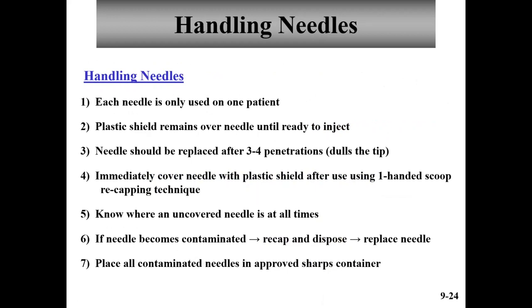You never, ever, ever reuse a needle and go from one patient to another, so it's only used for one patient. The plastic cap or shield should remain over that needle until you're ready to inject and should be replaced immediately upon injecting. You can re-inject a patient with the same needle 3 or 4 times. I wouldn't go more than 3 or 4 times without replacing the needle because it dulls the tip and it becomes uncomfortable when you penetrate.